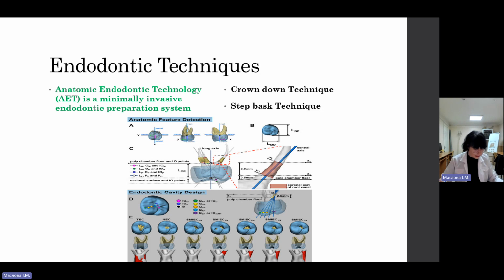The slowest recommended speed appears to be the safest. Always lubricate new rotary instruments, for example, with RC Prep jelly. Ensure they are in the support of the clinician's hand to compensate for patient movement and for better control of the instrument, and also to reduce their screwing-in effect. Ensure continuous irrigation, flooding of the root canal with sodium hypochlorite or another antiseptic solution during root canal preparation.